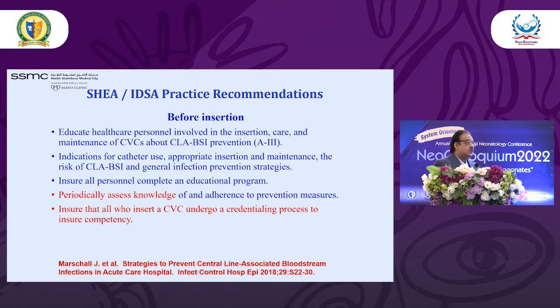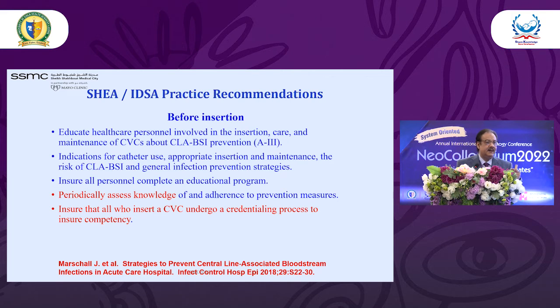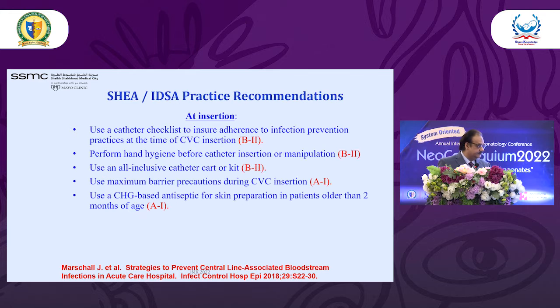Periodically assess the knowledge. So we have the assessment of our specialists who are putting in the lines, where we give them a mannequin and we see how they are doing it. And we are making a video. Again, this is not a political thing, we are not making videos of judges, but it is for our training purposes. So sometimes making a video is for a good purpose. Ensure that whoever will insert a CVC undergoes a credentialing process. So we cannot privilege everybody unless they go through the credentialing.